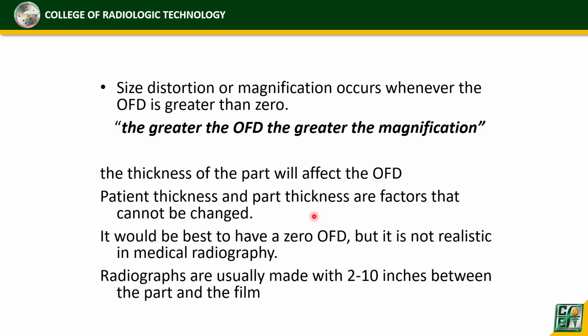Okay, the thickness of the body part will affect the OFD. Patient thickness and part thickness are factors that cannot be changed. Totoo naman. Di naman natin pwedeng tapyasan yung tissue ng ating x-ray, di ba? Then, it would be best to have a zero OFD, okay? But it is not realistic.